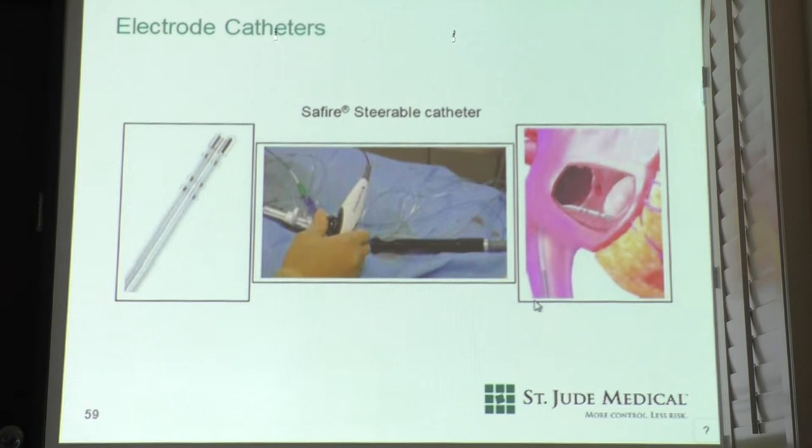Catheters are often steerable, so you can see the physician's hand has multiple different steering mechanisms, one that's like a butterfly, sometimes it's a push-pull, but it allows them to deflect it back and forth to make different shapes, and to deliver energy in the form of RF ablation to different spots. So what you heat, you kill, you cook, right? Dead meat don't beat. Once you give a scar in that area, the idea is that if it's an effective scar, and you deliver long enough, you kill that area of the heart. So ablation is fundamentally a destructive act. It's where we're at right now. Someday stem cells will make all of this seem like leeches, but this is where we're at.